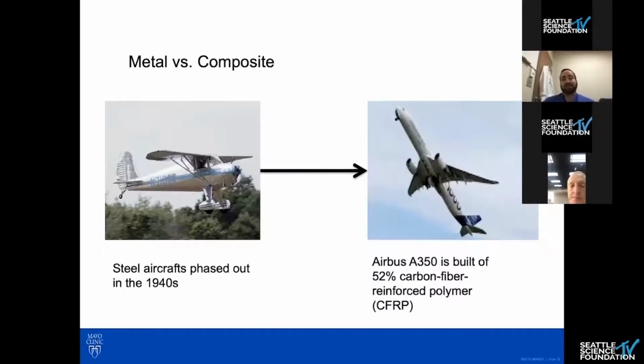And that's why we don't fly in steel aircrafts anymore. A plane, by virtue of the vibrations of not only the engine, but the air striking it, will eventually fatigue, and the old airplanes used to essentially fall apart midair sometimes. And that's why we're able to fly in airplanes built in the 1960s and 1970s, even to this day. These materials can withstand significant amount of cycling without disruption.